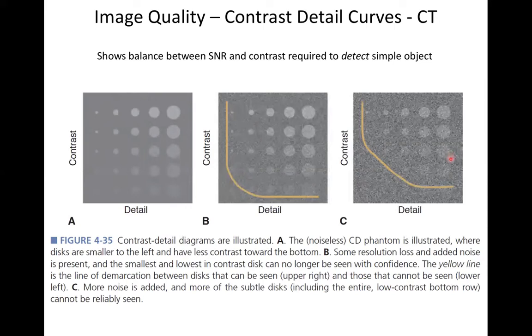Essentially you just have to give somebody this curve, right? And it's not terribly convenient to carry this curve around, because it depends on what the contrast is. And so most of the time, curves like this are used when you are evaluating, say, relative reconstruction techniques.